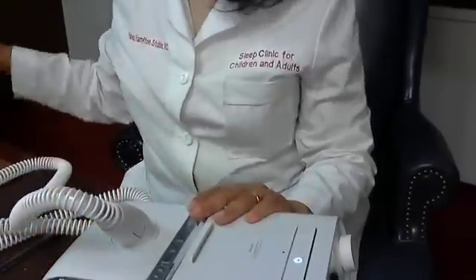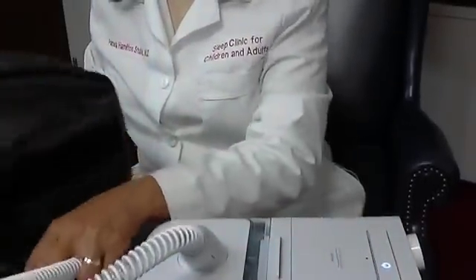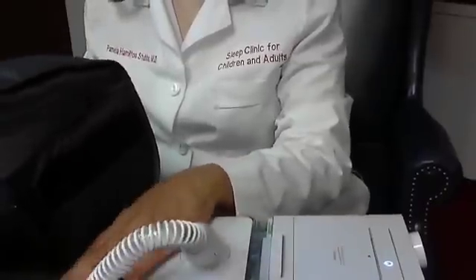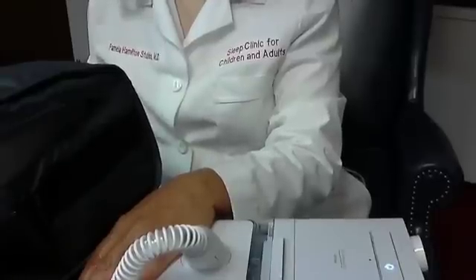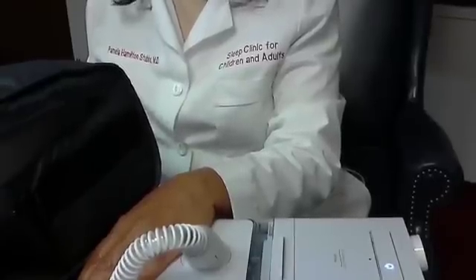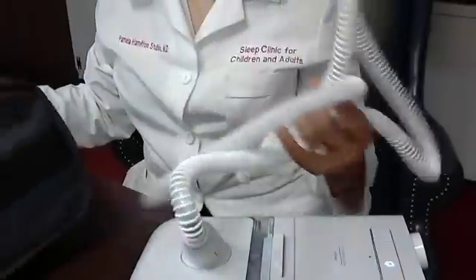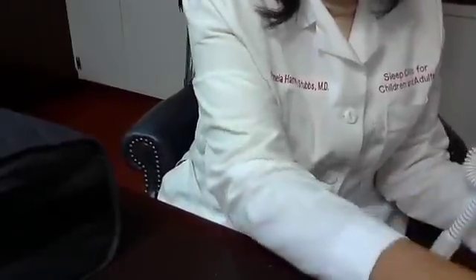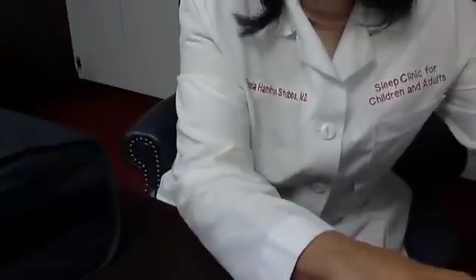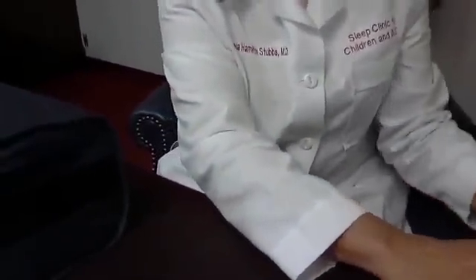When you are traveling, try to remember to take your travel bag, because these machines are very expensive and your insurance company may have a requirement of five to seven years before they'll replace your machine. So if you damage or break it, they may not replace it. The safest way to travel with your machine is with the travel bag.